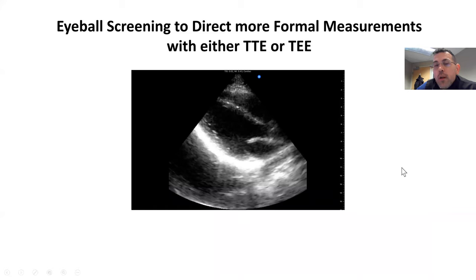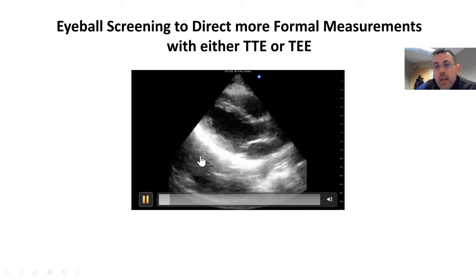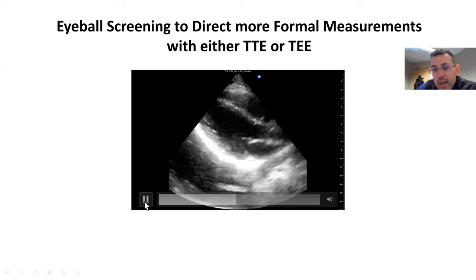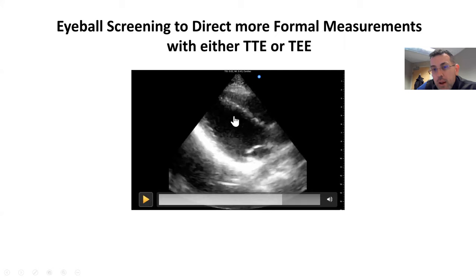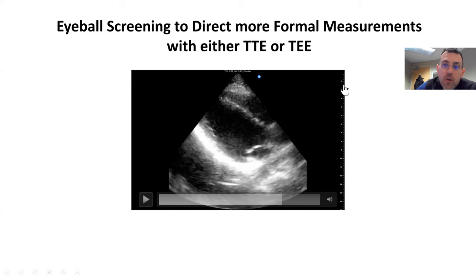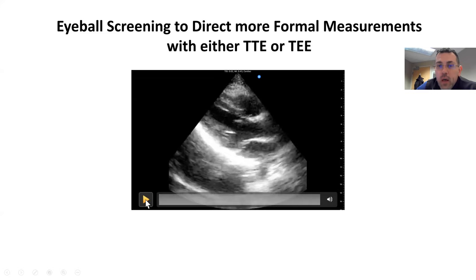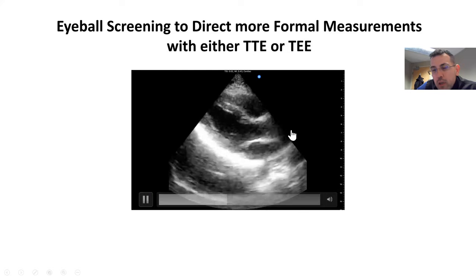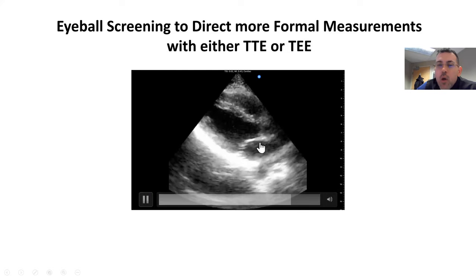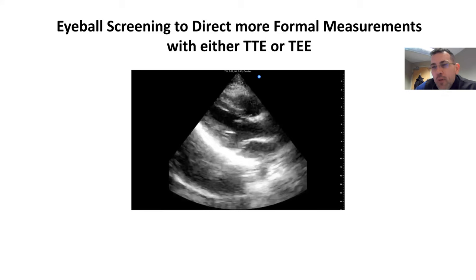Alternatively, we can catch this in end diastole and draw calipers across to get that same measurement. I also wanted to highlight that we have calibration markers on the side of the screen, and we can eyeball these things. Using the calibrations on the side, you can get a rough estimation just by looking — without putting the calipers on — to get a rough idea of whether you need to take time for more formal measurements if things start to look abnormal.